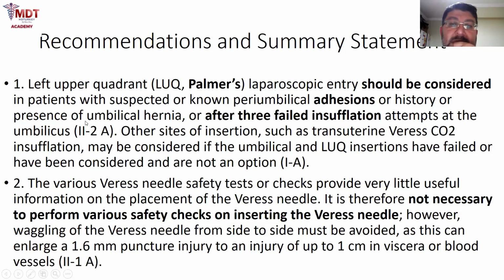The quality of evidence of this recommendation is two. The first number declares the quality of evidence for this recommendation. And in the second line, they do not recommend to perform safety checks for the insertion of the Veress needle. And the quality of evidence is also two for this one.